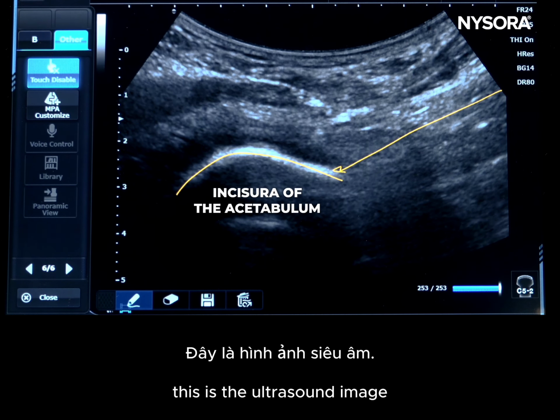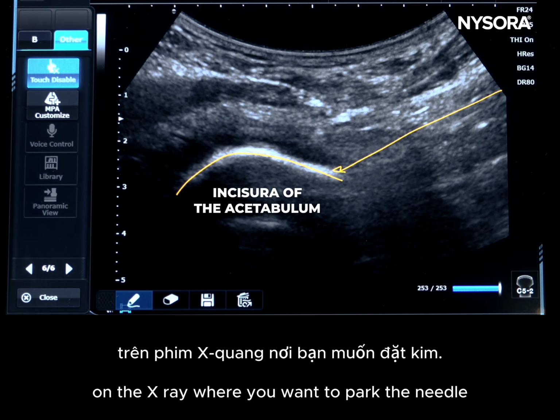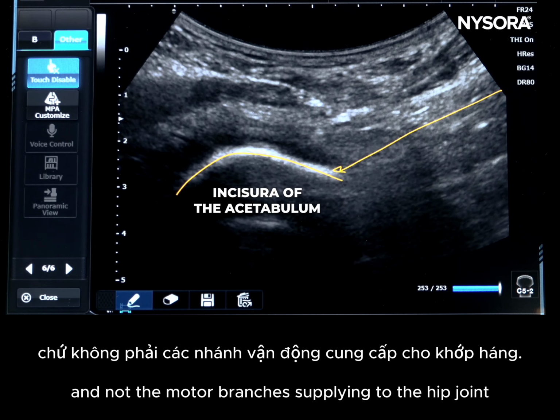This is the ultrasound image. You will correspond this with the teardrop sign on the x-ray, where you want to park the needle on the lateral aspect of the teardrop, because you are interested only in blocking the articular branches and not the motor branches supplying the hip joint.